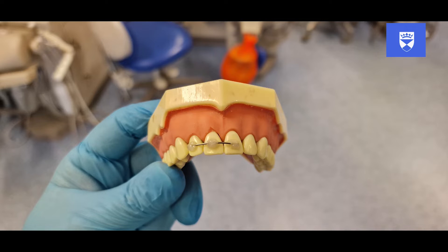The first method we will show you in this video utilizes an orthodontic debonding bur in order to remove any composite from the wire splint. The second method we will demonstrate involves using orthodontic bracket removers to quickly and efficiently remove the composite fixing the splint to the teeth.